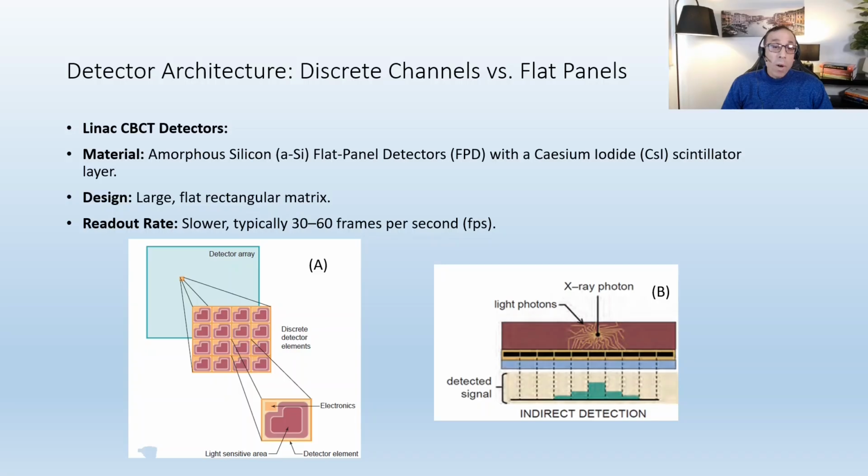If we have one X-ray photon here and one interaction, in the detection part we can see that 1, 2, 3, 5 detector elements are receiving the signal. So 1 point shows itself as a 5 point. It is some sort of spatial resolution degradation.